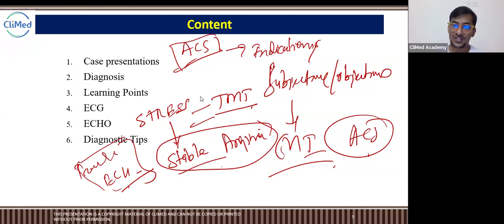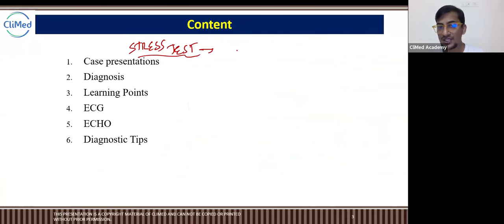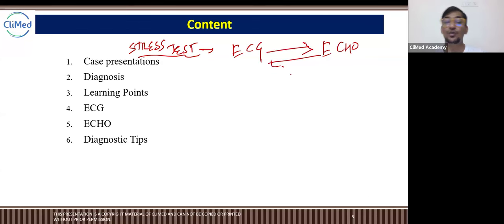What is the process of a stress test? Let me tell you a little bit. Today we are not covering everything; everything we'll cover in the classes. So a stress test is either ECG or echo. I mean, it functions the same.